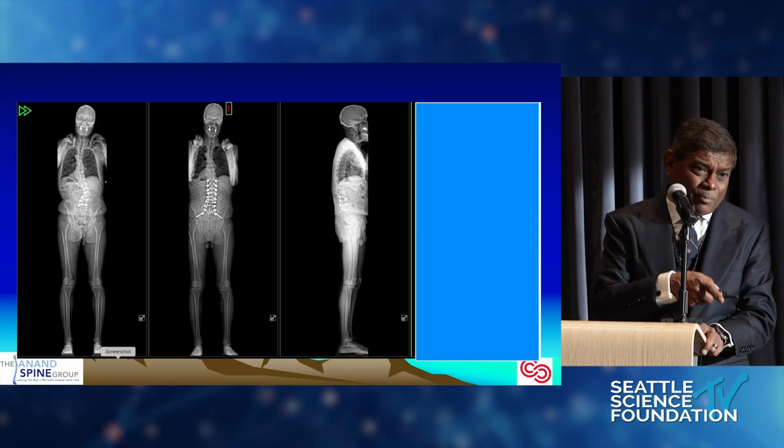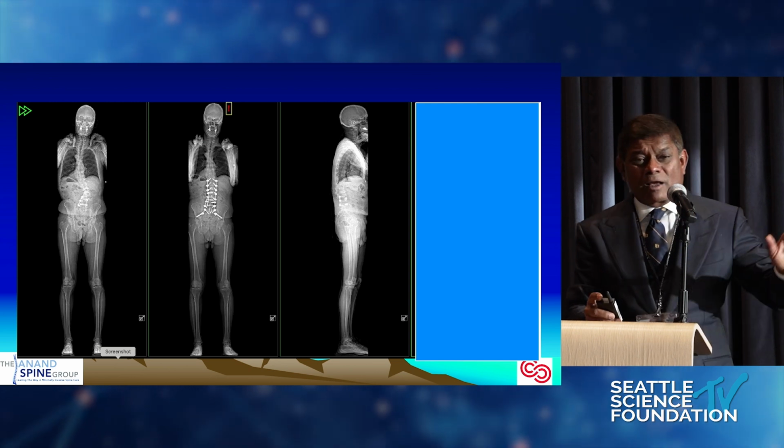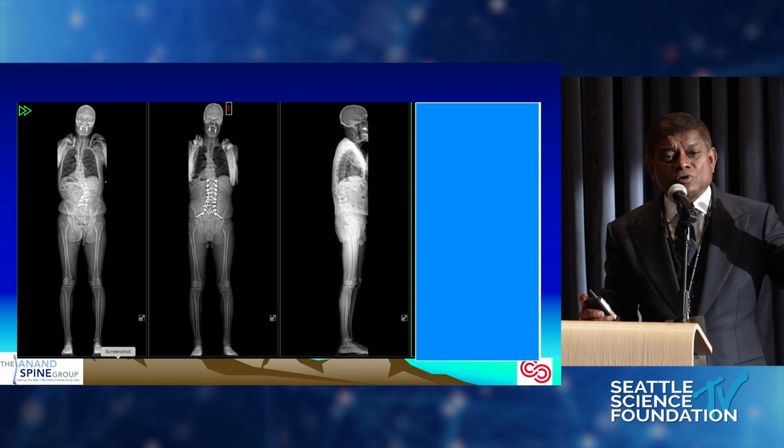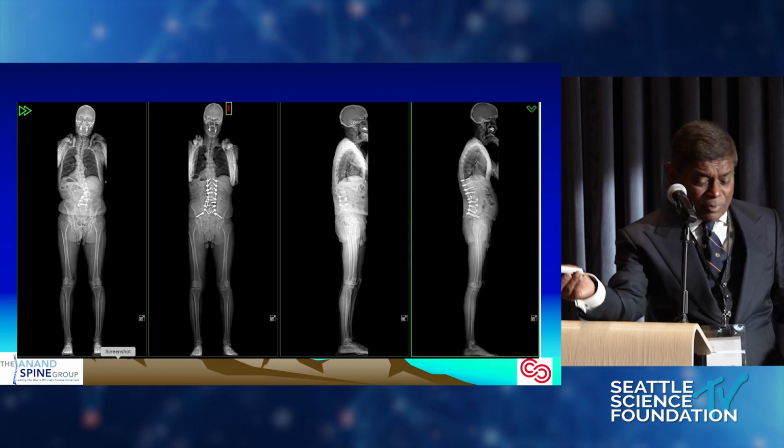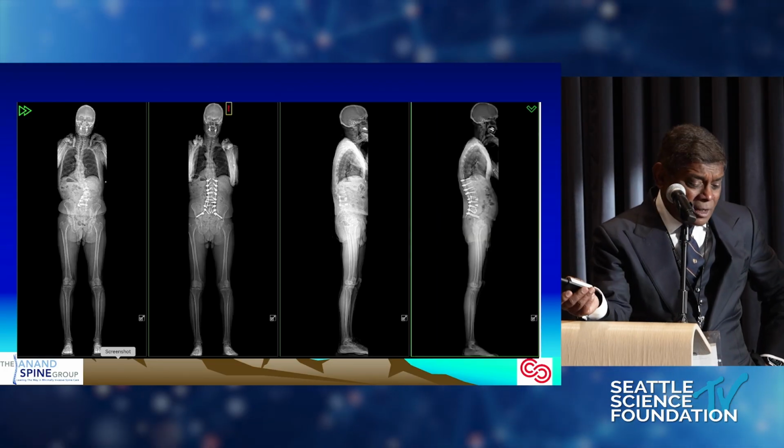The whole series of that is being published now. About 15, we call it the robotic bypass technique. Well, leave those screws alone. Why the hell do you want to go in there? It's fused. Work your way up and down, correct your deformity, line it up. And so you can get these done, and that's what's coming up.